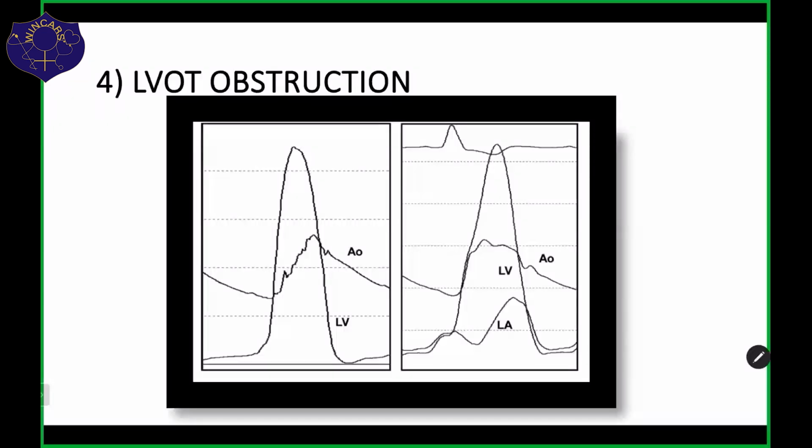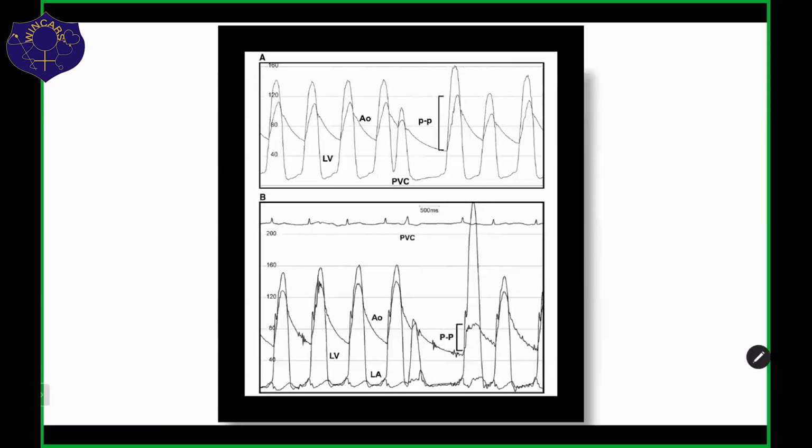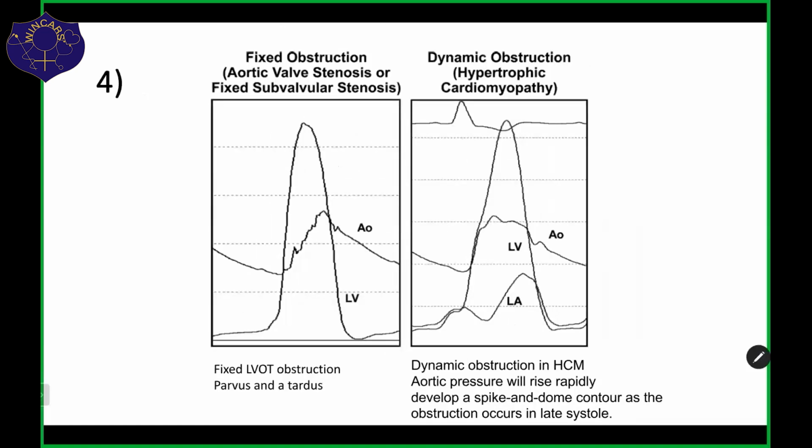Yeah, correct. This is one of the classical textbook descriptions and the graphs we have already seen. So in the interest of time, I'll just run through this. The only thing is the pulse pressure that we have to see. This is the classical Brockenbrough phenomenon. This slide is self-explanatory, where the left picture shows pulsus parvus et tardus, and the right one is a dynamic obstruction.